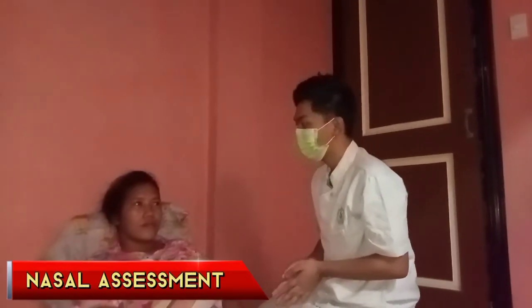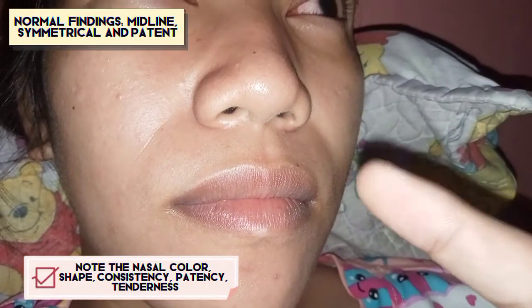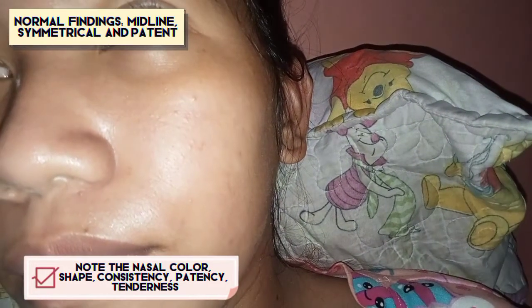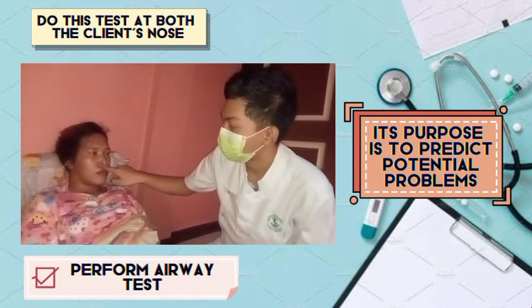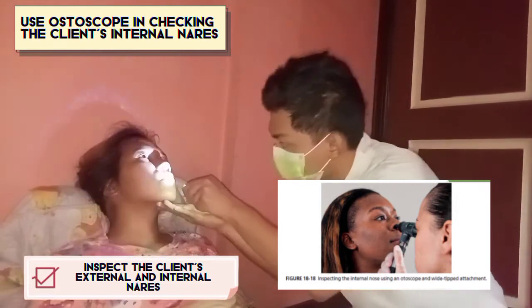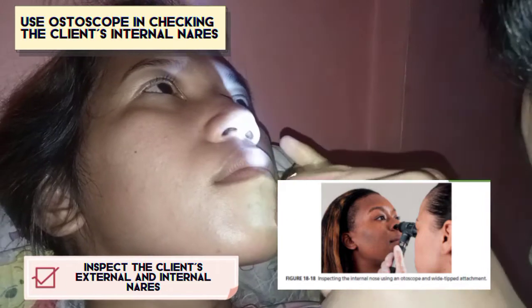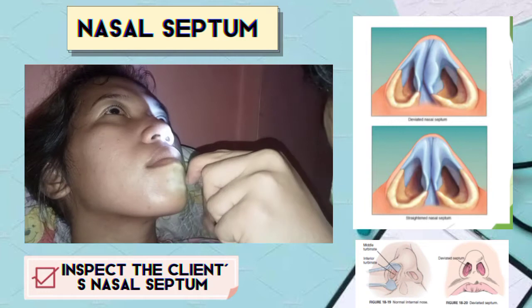Okay, ma'am. Now I'm going to inspect your nose. Okay. In checking the nose, note the nasal color, shape, consistency, patency, tenderness. Next, perform airway test. Next, inspect the client's external and internal nares. Use otoscope in checking the client's internal nares. Next, inspect the client's nasal septum.